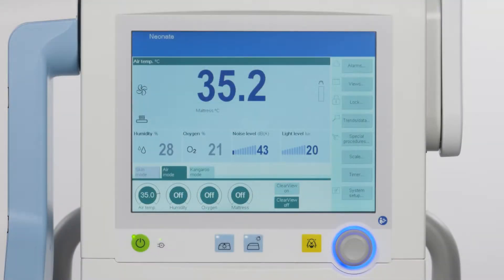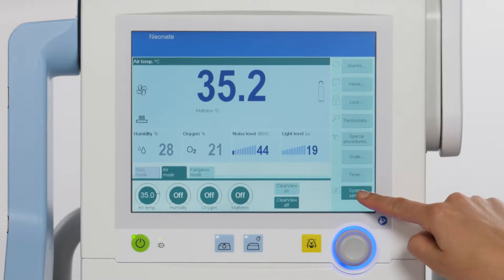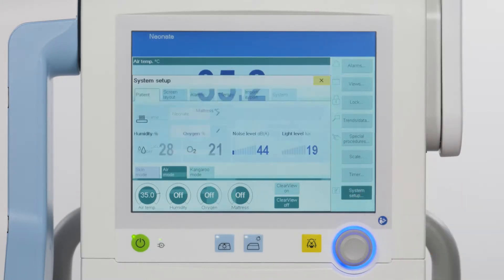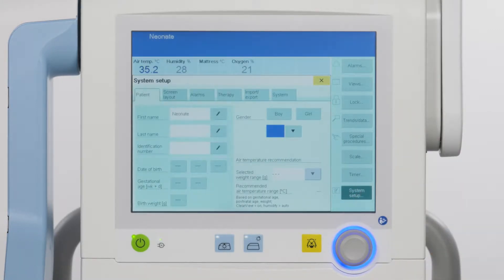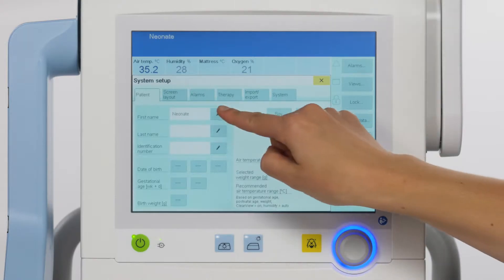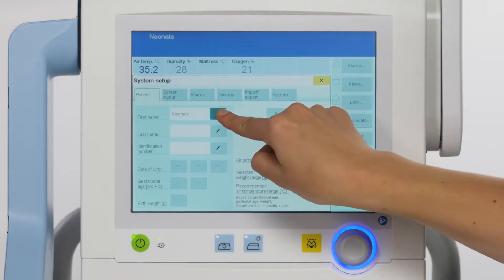This part of the video will demonstrate how to enter patient data. Touch the system setup button on the main menu bar. To enter data, touch the pen icon on the display.